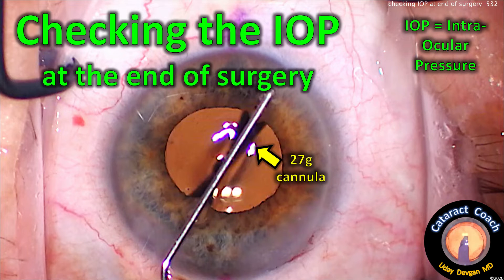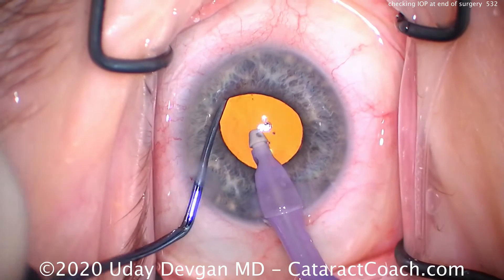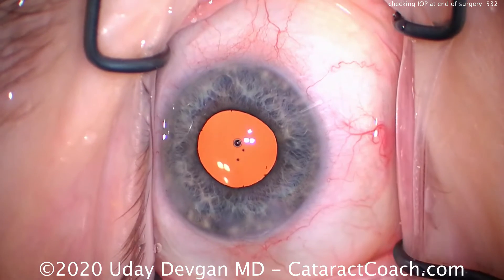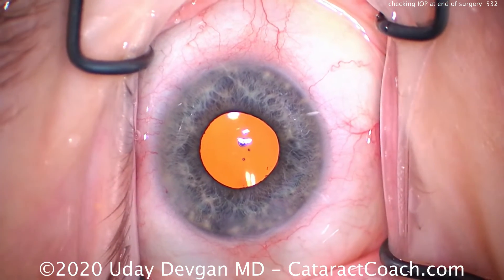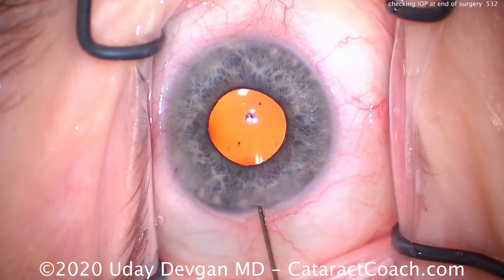CataractCoach.com. Checking the IOP, or intraocular pressure, at the end of surgery. We're finishing up a case here, removing viscoelastic, just orienting a toric lens. The traditional way of checking intraocular pressure is using something with a gauge, like a Schiøtz tonometer, a Tonopen, or even a Baracare tonometer. All these are very good and accurate — a good way of measuring the pressure. But what if you don't have these devices? Can you check the pressure in another way?